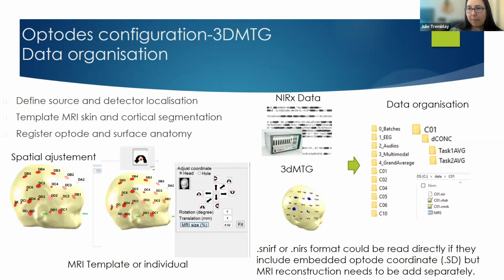If you need, as an example, a small rotation of the MRI could be necessary if the cap were placed at the bottom or the top of the front end. So we measure the cap position during the NIRx recording to ensure good consistency among our subjects, and take pictures of the installation to be sure that the registration represents the reality of the recording.